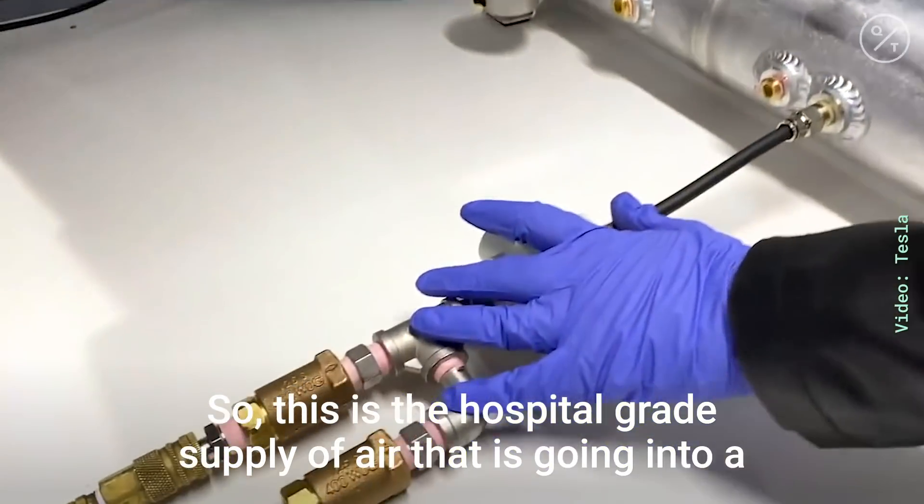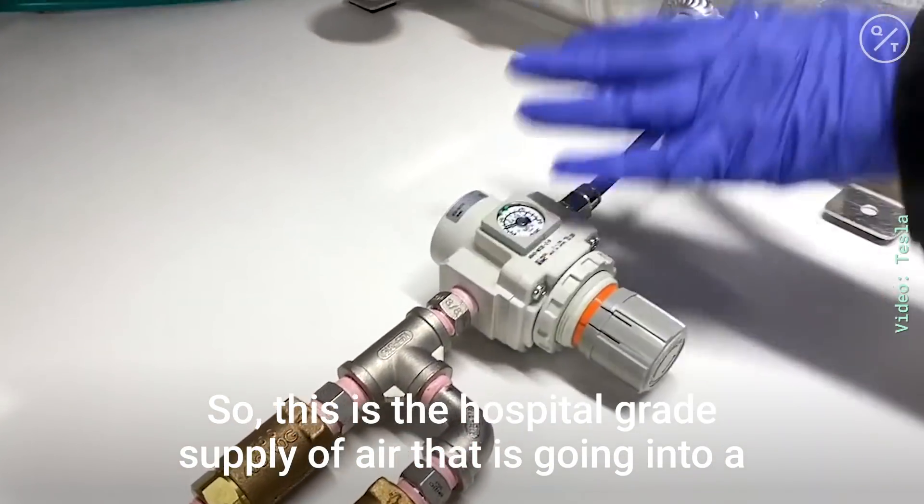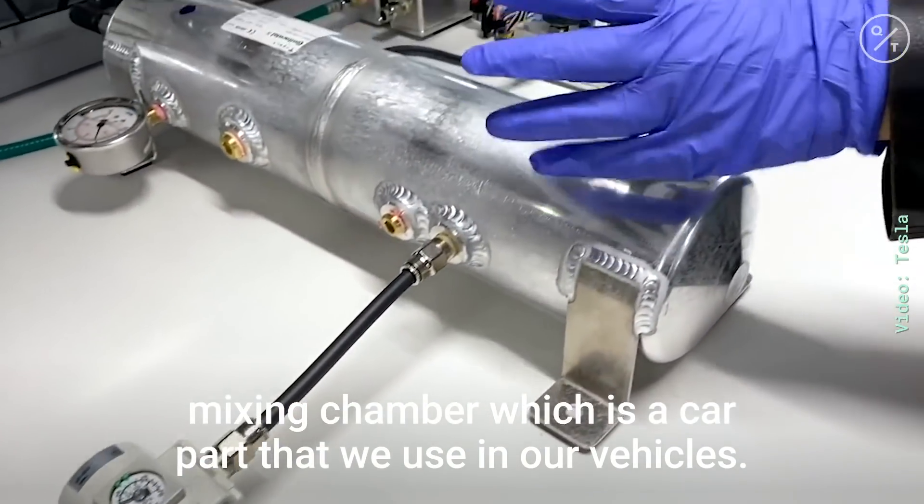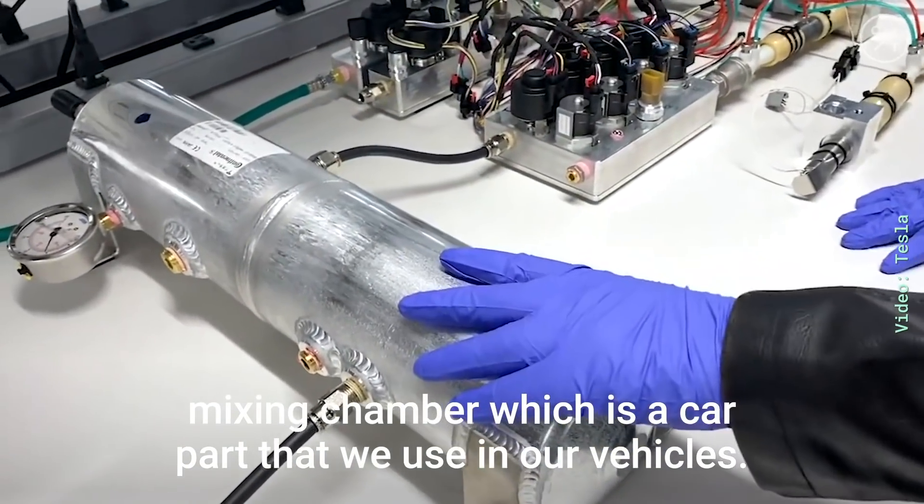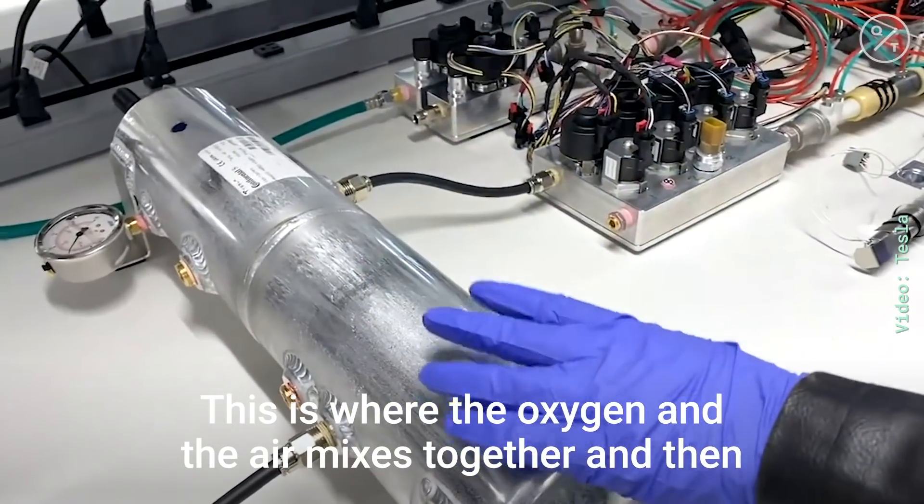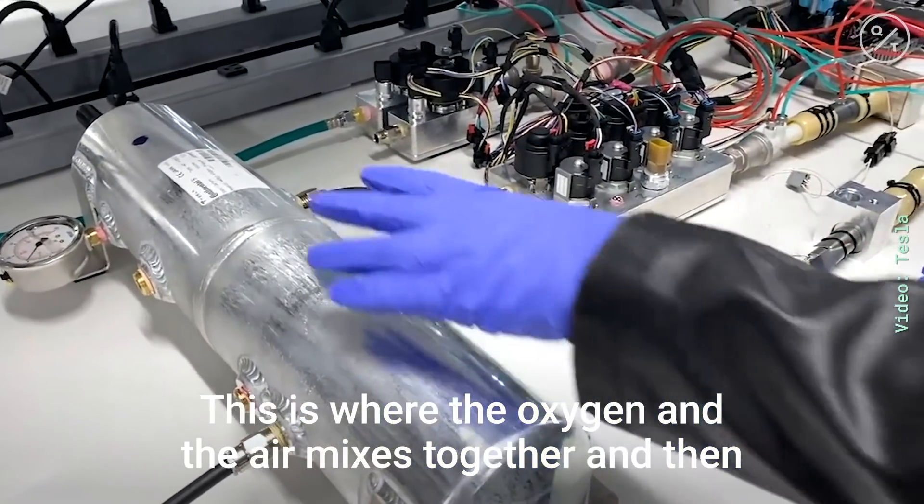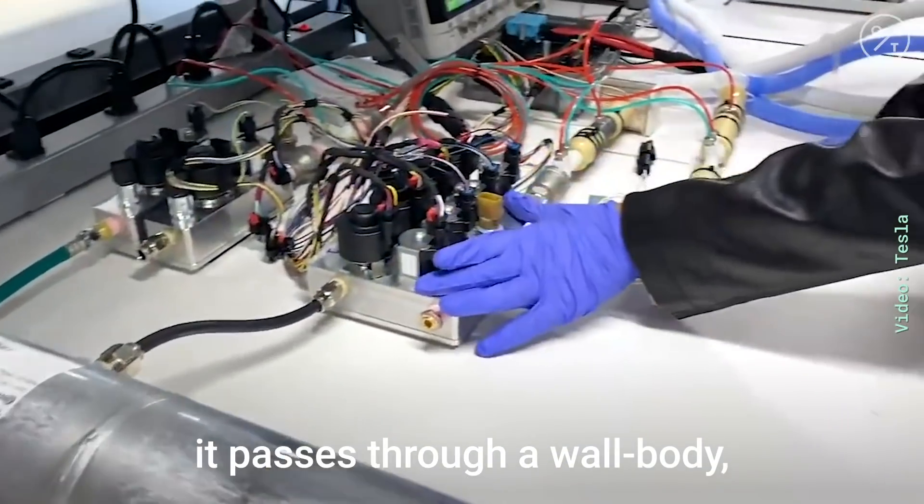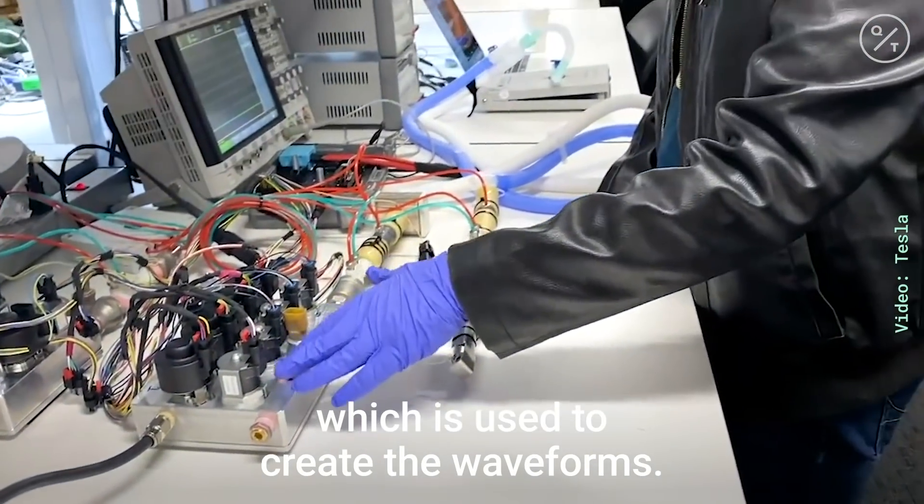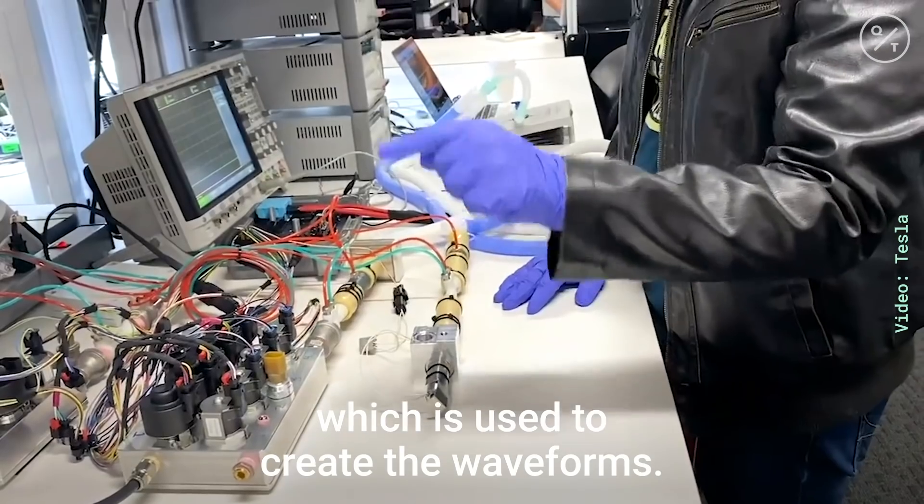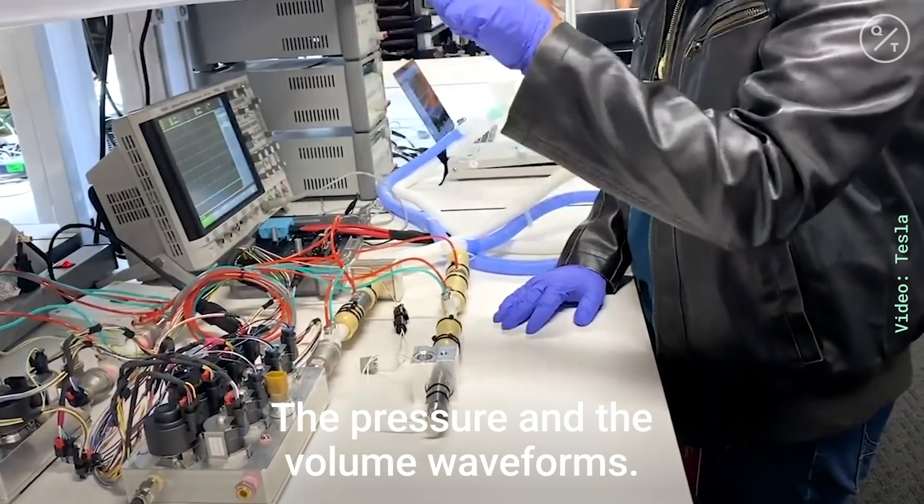So this is the hospital-grade supply of air that is going into a mixing chamber, which is a car part that we use in our vehicles. This is where the oxygen and the air mixes together and then it passes through a valve body which is used to create the waveforms, the pressure and the volume waveforms.